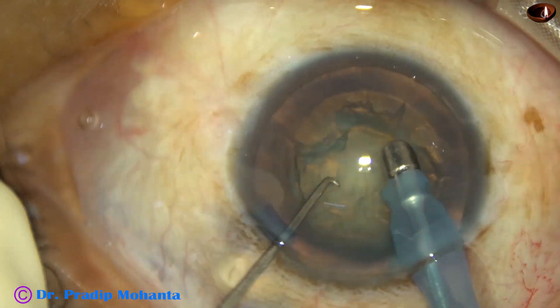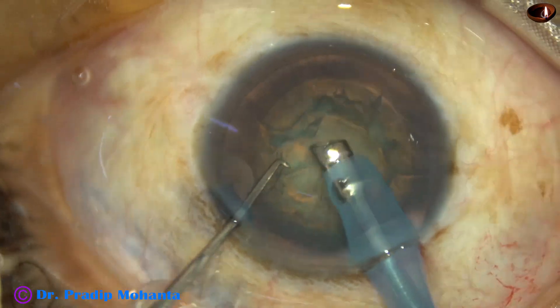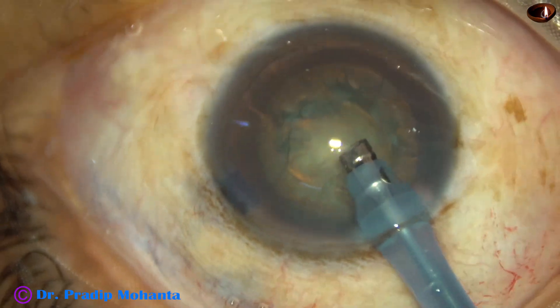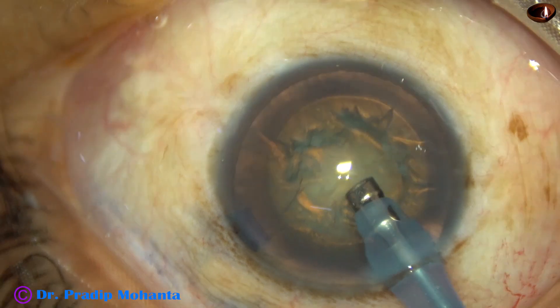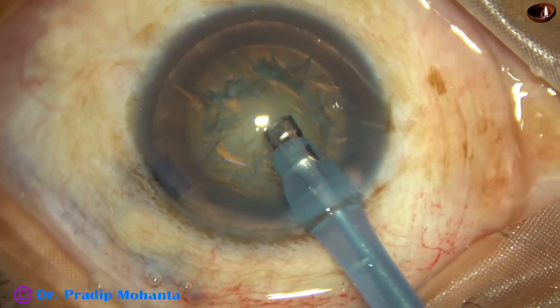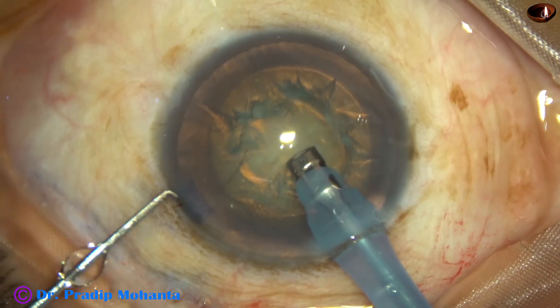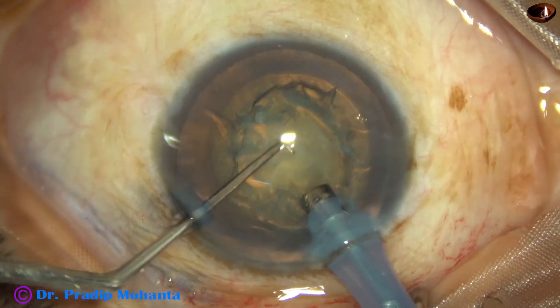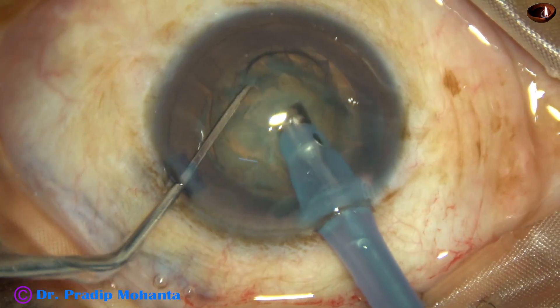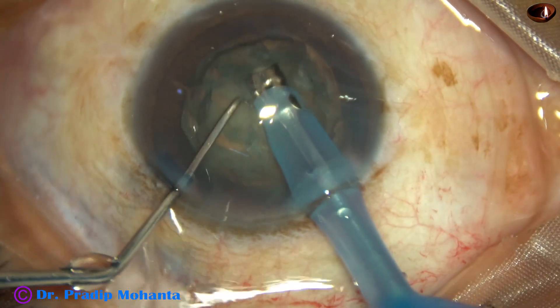Now, some superficial lens matter is aspirated and now I am going to make a trench. The tip of the phaco needle starts the trench just in front of the rhexis, just in front of the main wound. And it goes towards the opposite equator.